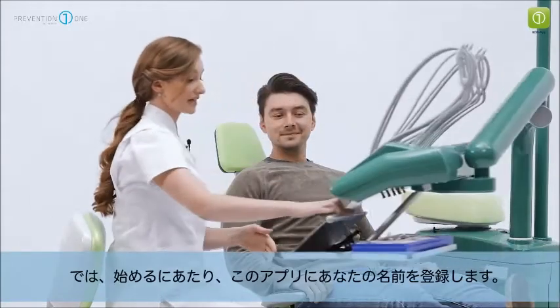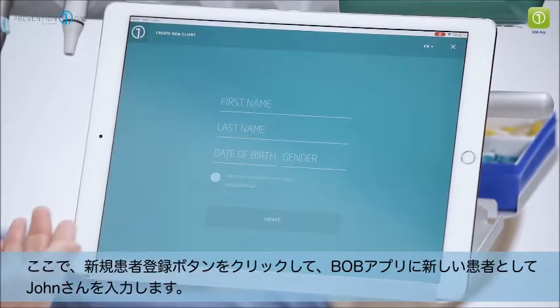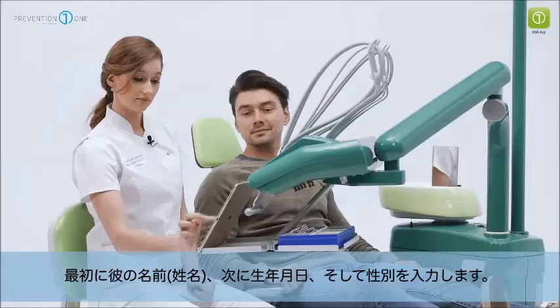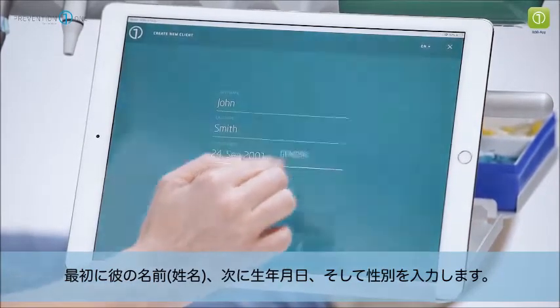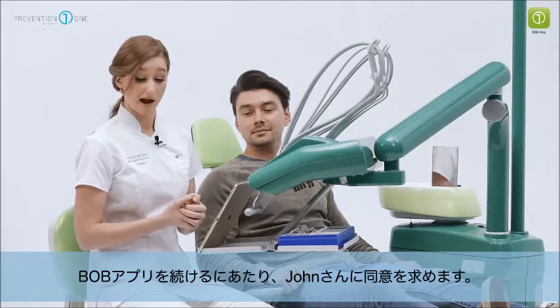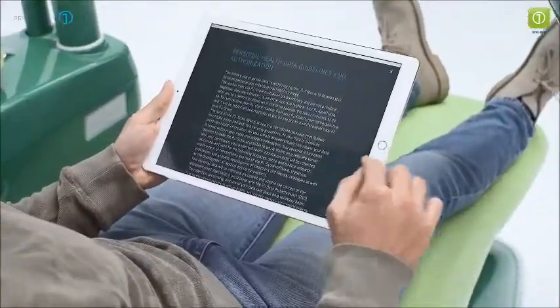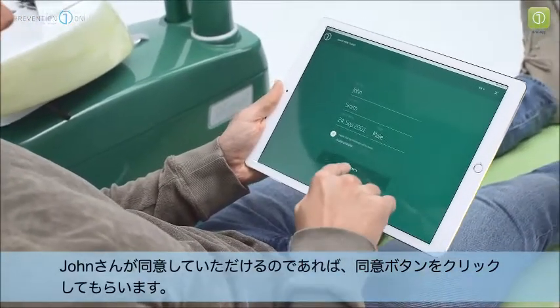Before we begin I need to add you into the system. I'm going to click on the add new client button and here I'm able to place John as a new patient in the Bob system. So first I would click in his first name, his last name, his date of birth and his gender. There is consent that John has to give me before we continue, so I'm going to pass the tablet to John to read the data guidelines and authorisation. If John agrees he is then able to click the agree button.